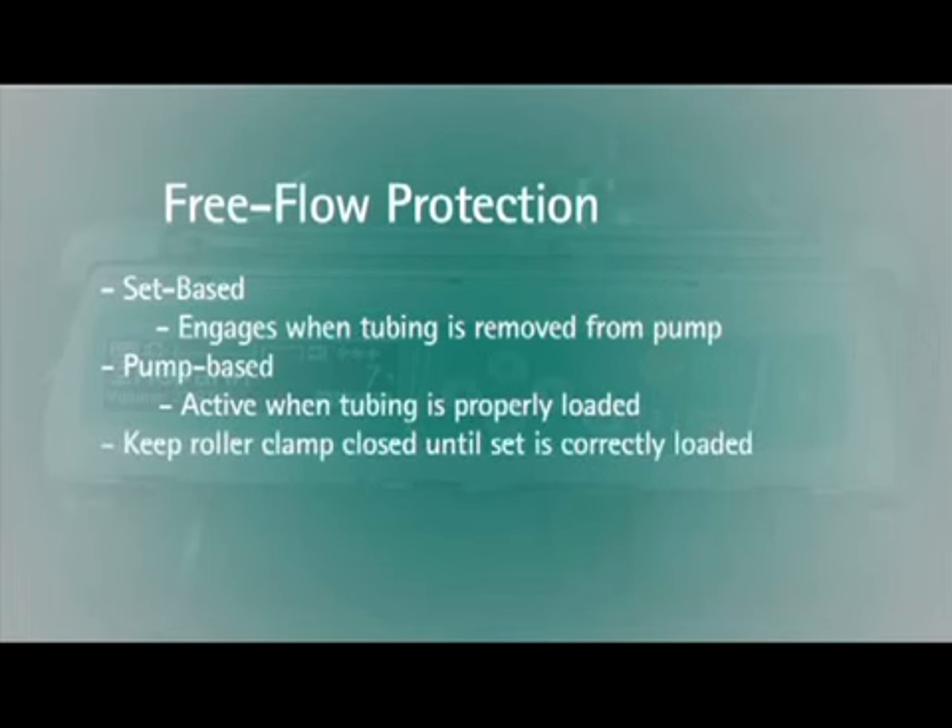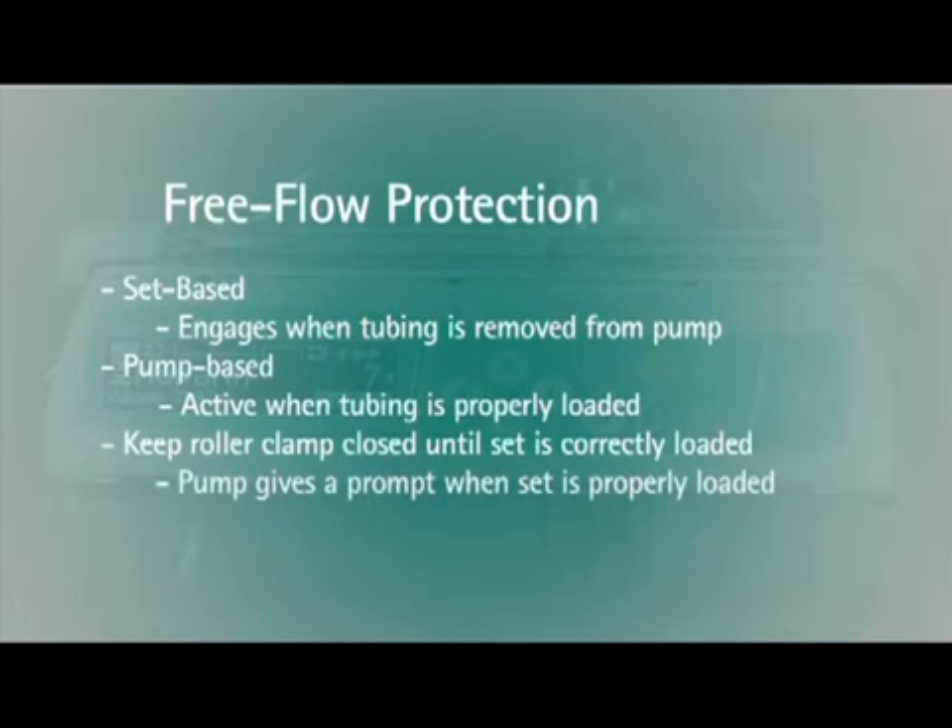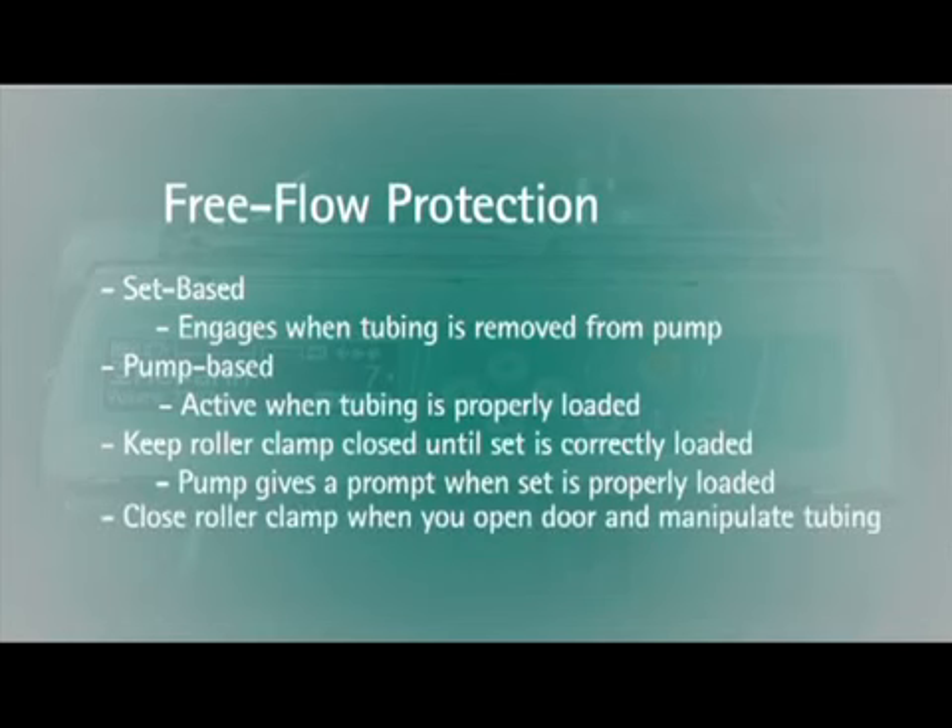It is important to keep the roller clamp closed until the IV set is correctly loaded into the pump. The infusion pump will provide a brief prompt to open the roller clamp once the IV set is correctly loaded. Close the roller clamp any time you open the door and manipulate the tubing while it is connected to a patient.